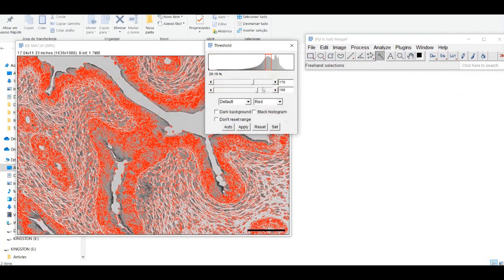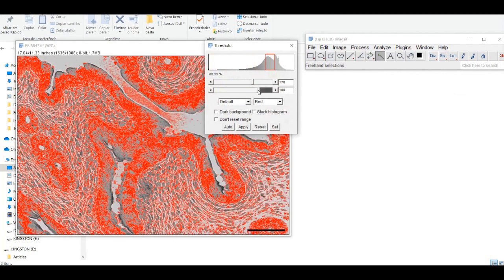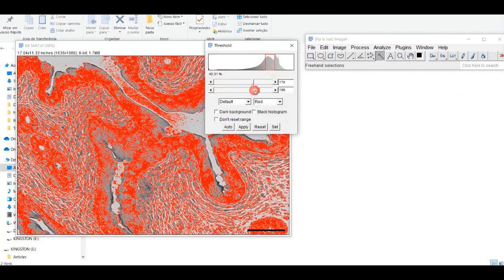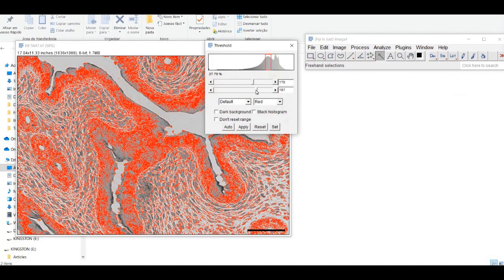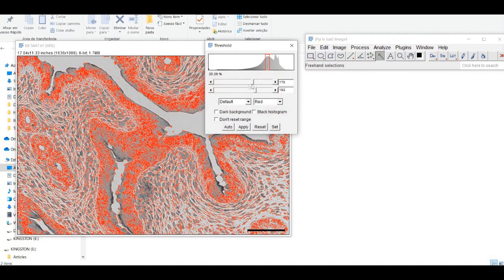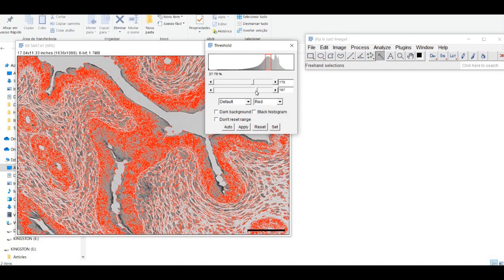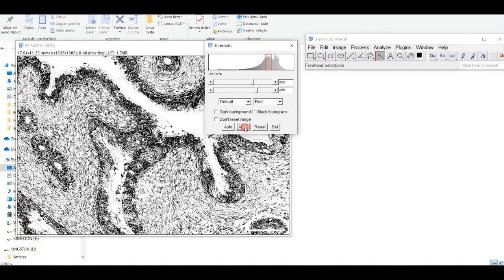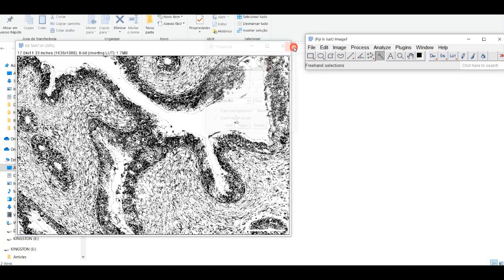Use the wand tool to select the areas of the image corresponding to the regions of interest, then you can use the Analyze Particles command to measure the mean intensity of the pixels in those regions.